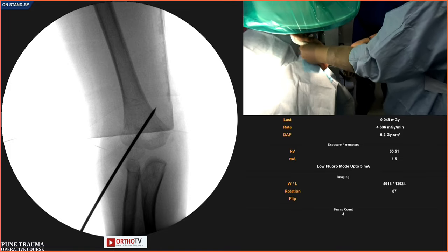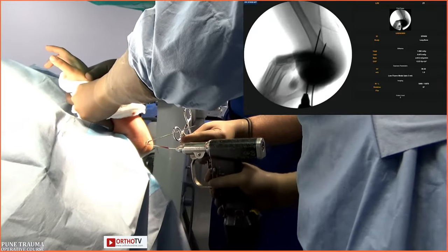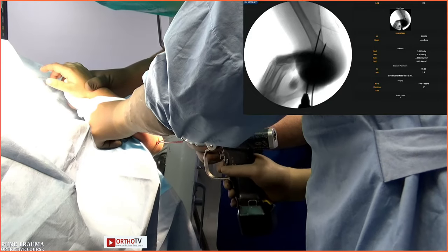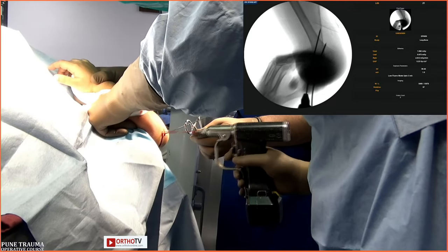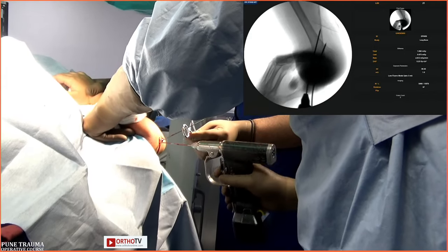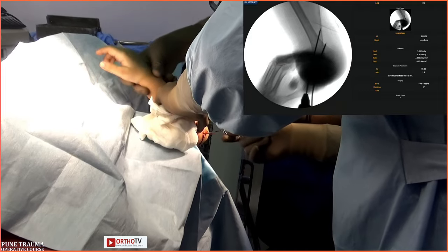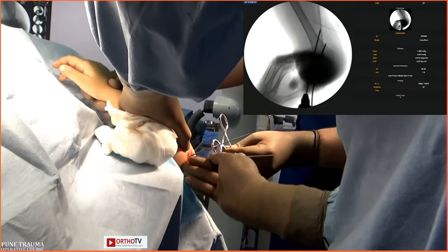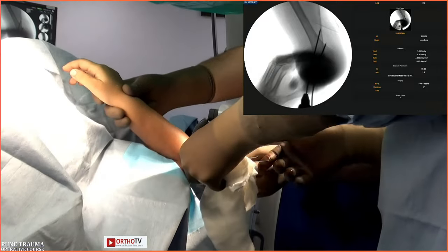Clinical picture larger, please. So just one more trick for the audience. What I do is I take a 16 number or 18 number needle and put it on the skin to know my direction of the wires. And then I will confirm it and then pass a K wire along the same direction. With that, you avoid multiple passages through the cartilage and the soft bone. Like you said, Taral, we put it on the skin. You can hold it with your hand and feel the bone. And this is what you wanted me to show, right? So once I am on bone, I can feel that I am on bone.